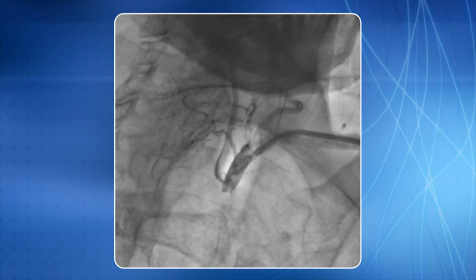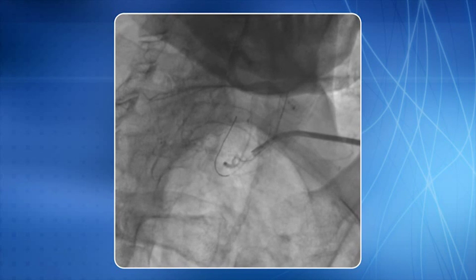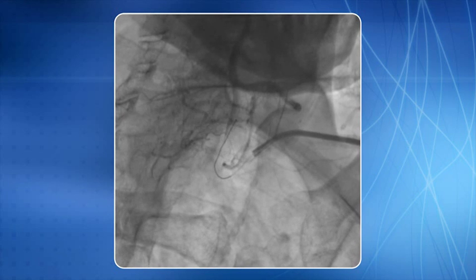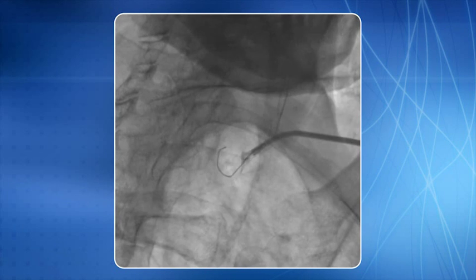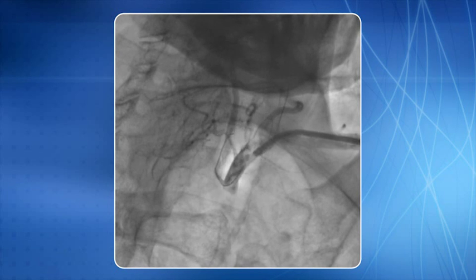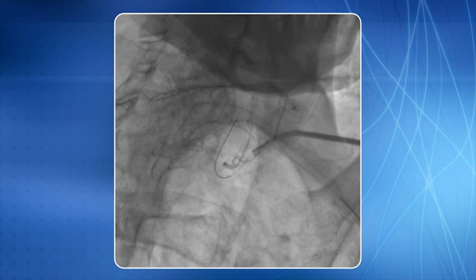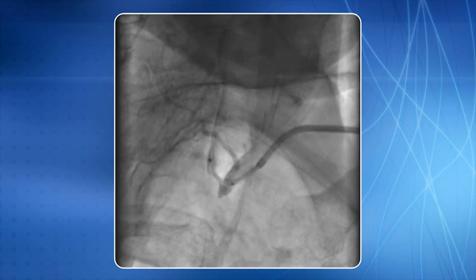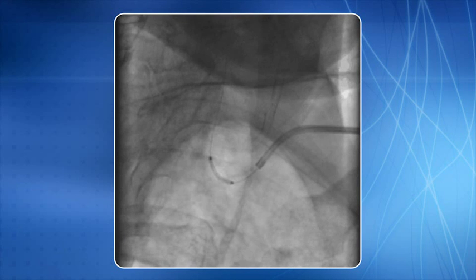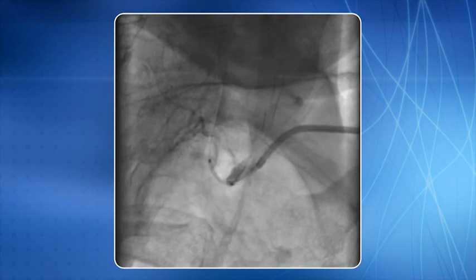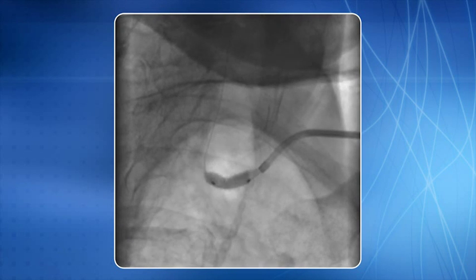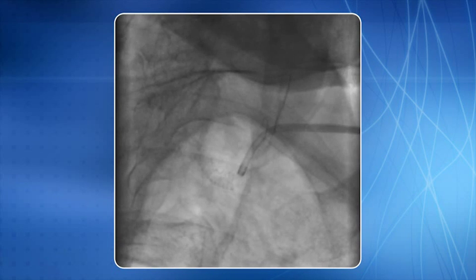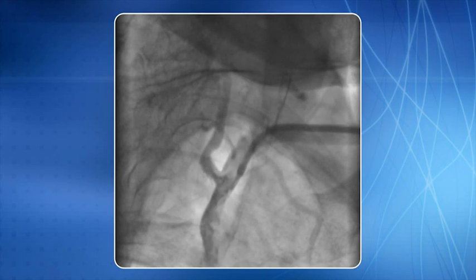A 6F JR4 catheter has been used and a 0.014 inch BMW PTCA guide wire is negotiated deep into the vertebral artery. A balloon expandable stent is placed across the lesion. Stent deployment is in progress, and this is a satisfactory end result.